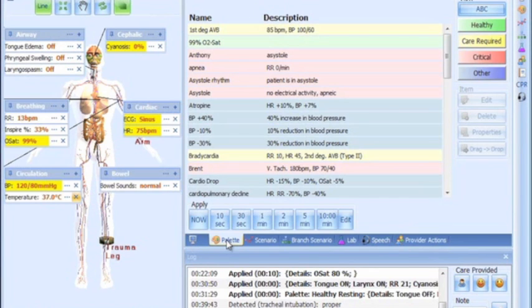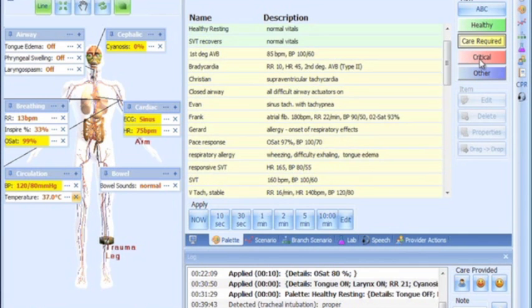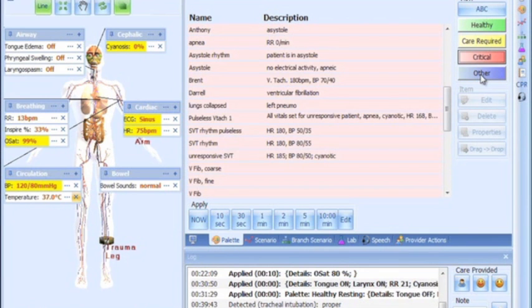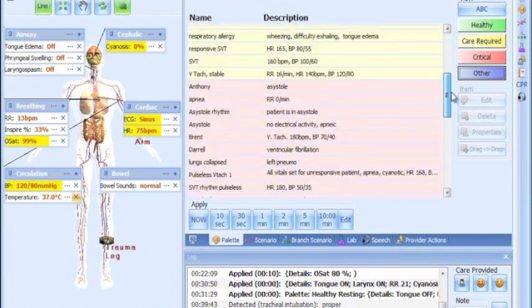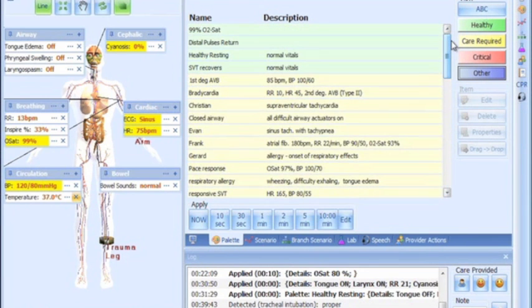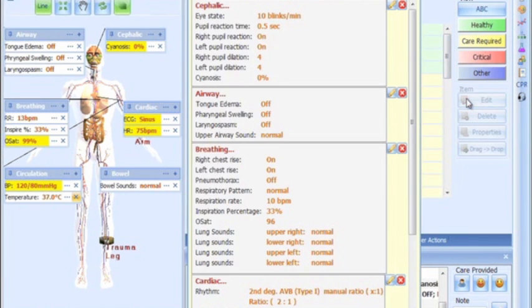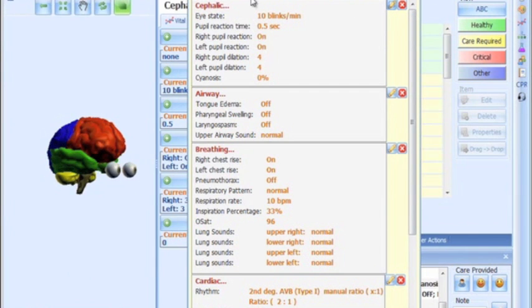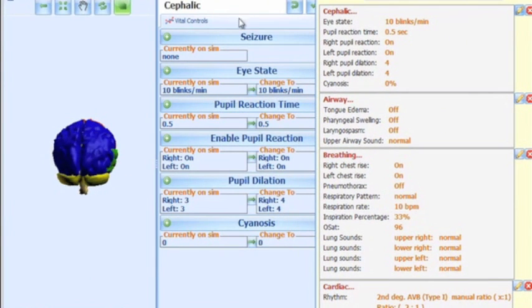Palette items that have been saved from the details window are displayed in the palette tab. For visual clarity, palette items appear in four different colors depending on the desired condition of the patient. Palette items can be altered at any time by clicking Edit, which opens up a details window with all vitals arranged per region.